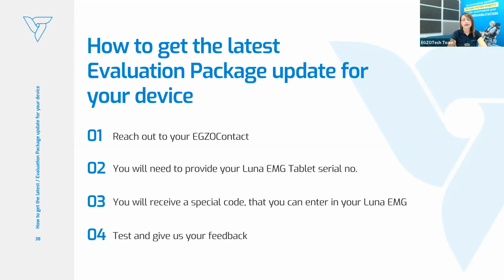Also, if you're thinking about providing more research, or you're thinking about the next project you would like to do, we are able to use all of those tests in research. It's great if we could cooperate with some of you in terms of validating them for how repeatable they are, and if they're great for research.